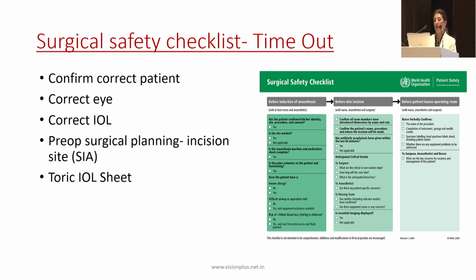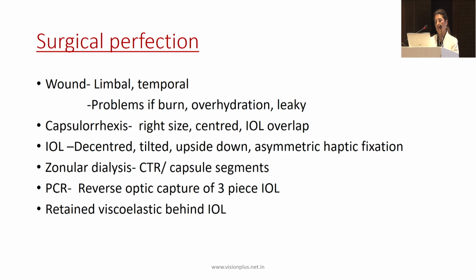So that should be confirmed. The correct IOL is available in your OR. And of course, you must also know your incision site and planning, and put up your toric IOL sheet. That should be displayed. Surgical perfection goes without saying. We are all excellent surgeons.